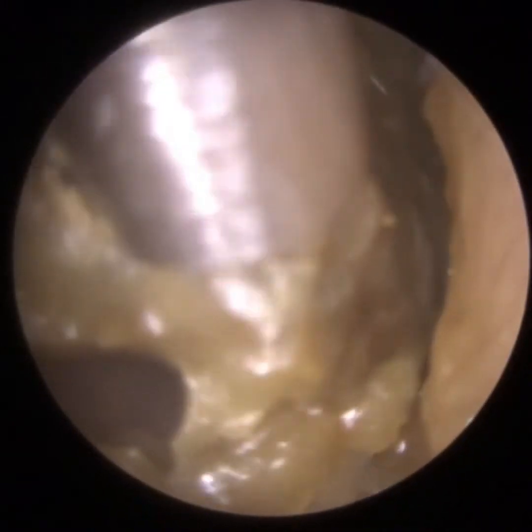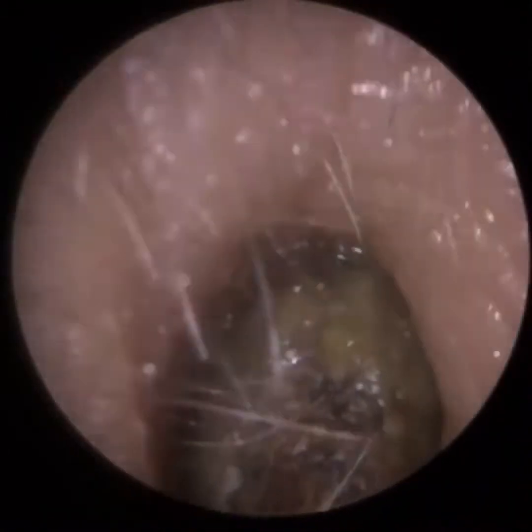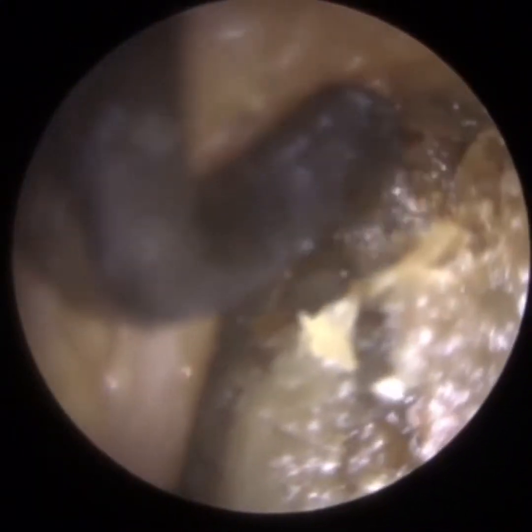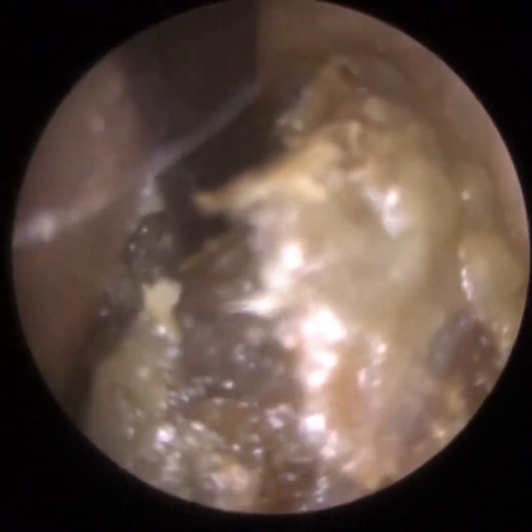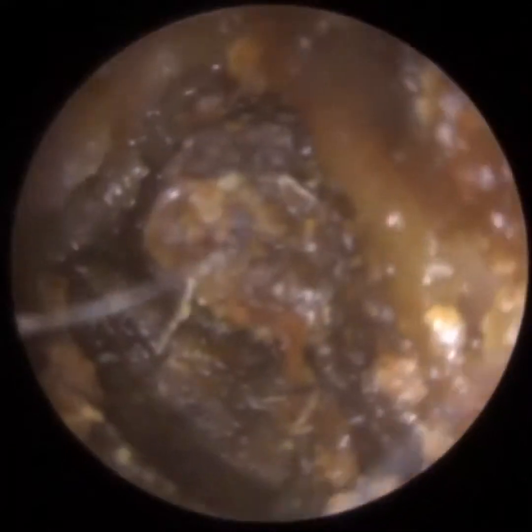And it's obviously quite difficult when we're doing these procedures because the ear canal itself, the average width of an ear canal, does vary at different stages from the entrance to the eardrum. But on average, you're looking between 6 and 8 millimeters wide and around 7 to 9 millimeters in height. So it's a very small orifice that we're operating in, and any slight movement by the patient can obviously cause them to knock their ear against the instrumentation that we're using.